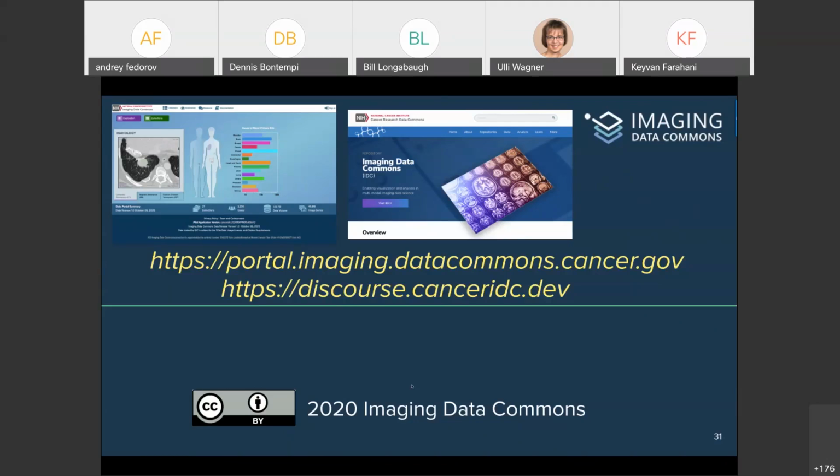Thank you, Steve, for answering at least 2 of those questions. So the first question is from Daniel Rubin. Is the search limited to DICOM headers, or can you search for associated clinical data or data types of image annotations? Yes. The search that you see in the IDC portal is mostly about searching the DICOM header.